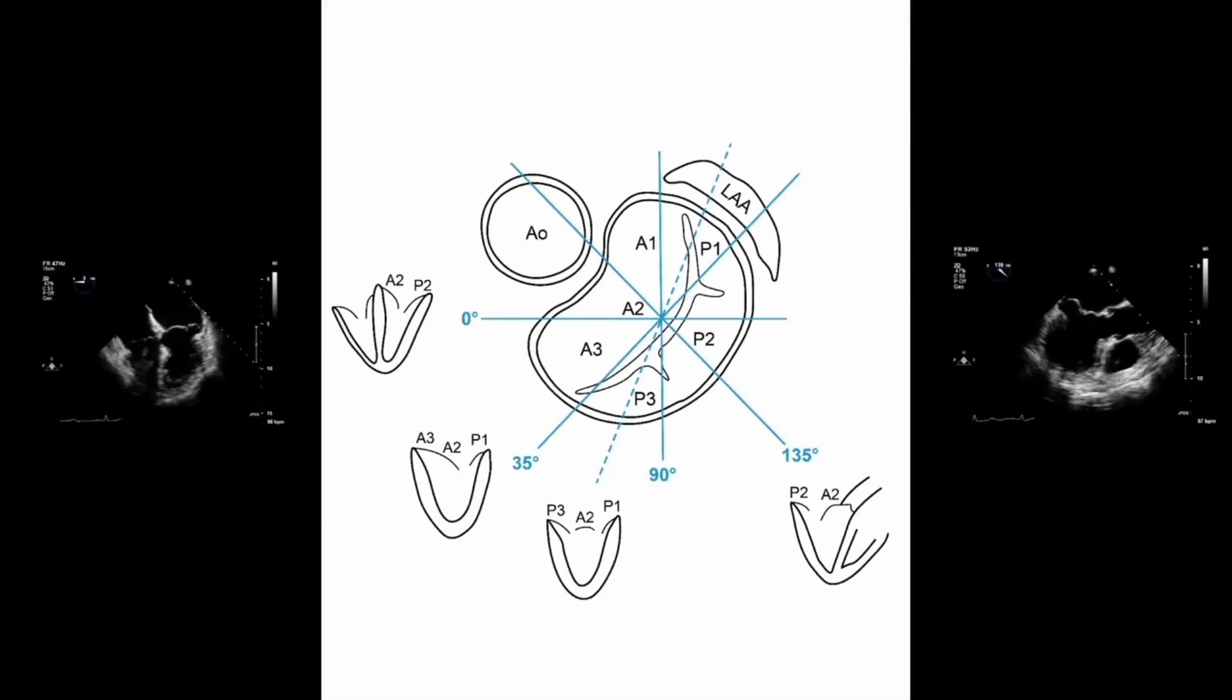By way of an example, here are two views of the heart. On the left hand side of the screen we have a mid-esophageal four chamber view which is equivalent to what we're seeing in the diagram just alongside it.